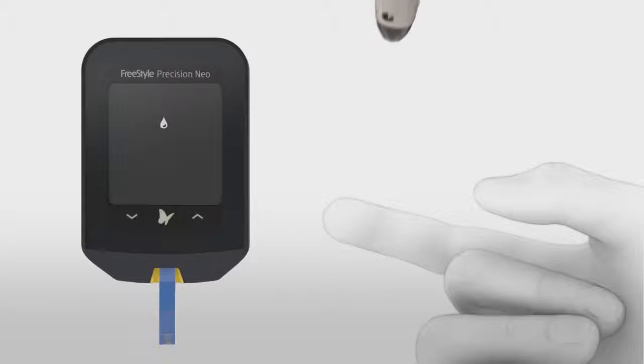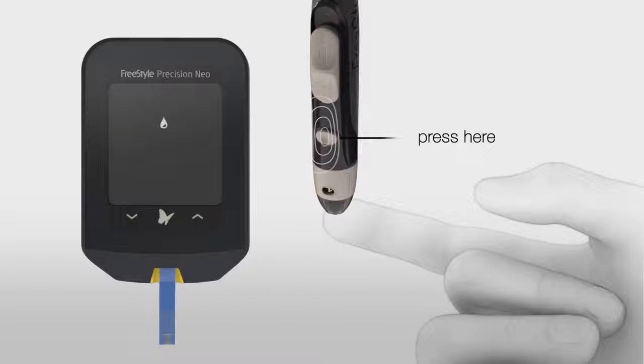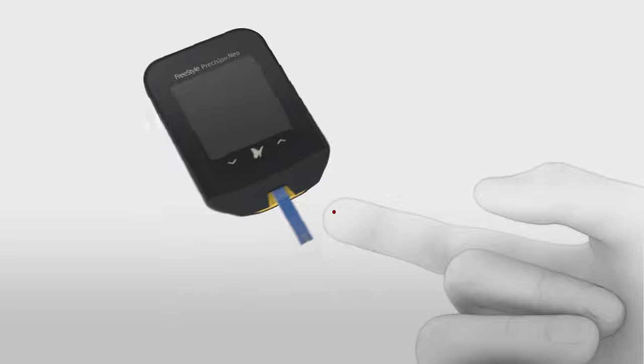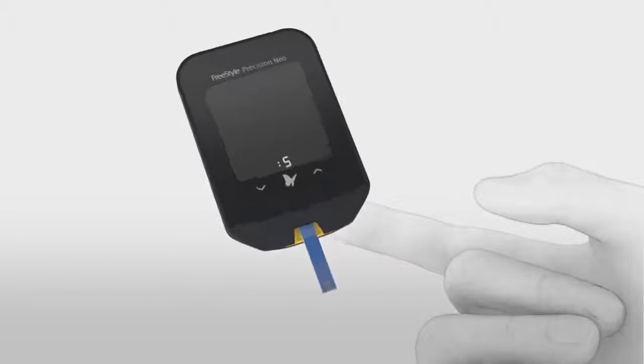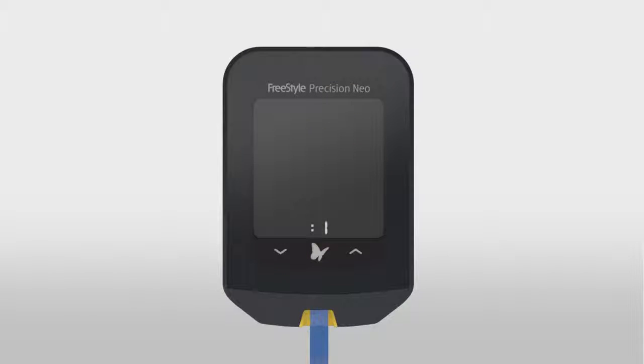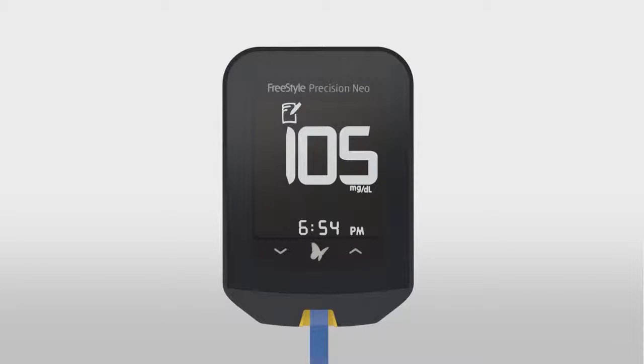Use the lancing device to obtain a drop of blood. Bring the blood drop to the white area at the end or top of the test strip. Hold until you see three short lines. You will now see a five-second countdown until your result is ready.